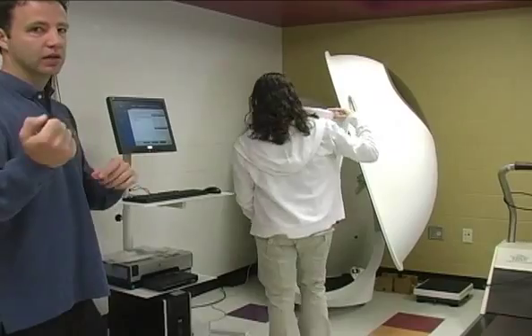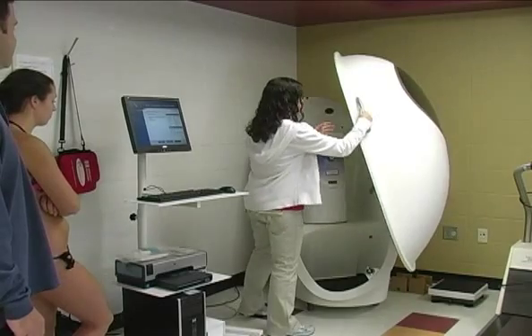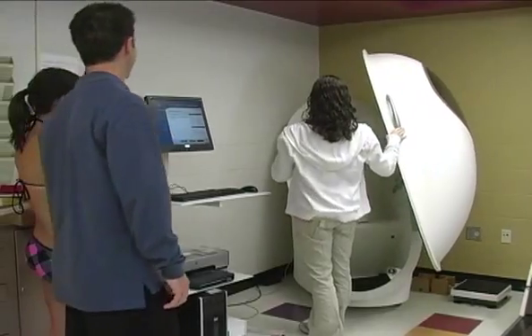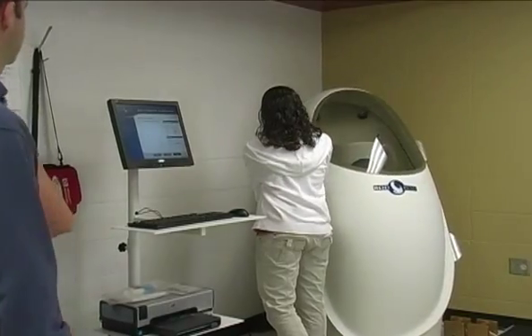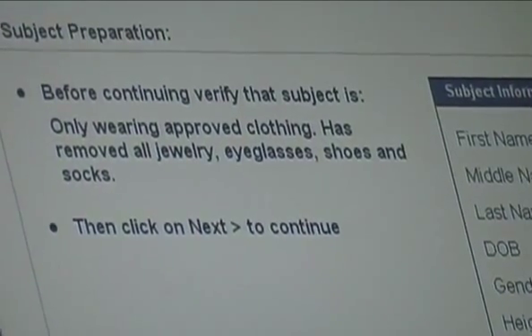So the process is open the door, click next, close the door, click next. And just so the cylinder's on the seat, upright. Oh, doesn't say close the door yet. Very good catch. So click next. And we close the door. In research, you want everything consistent, so that's why it's set up that way. And the two-point calibration is because you want to ensure the accuracy and validity of the BOD pod each and every test. So it's a built-in quality control.